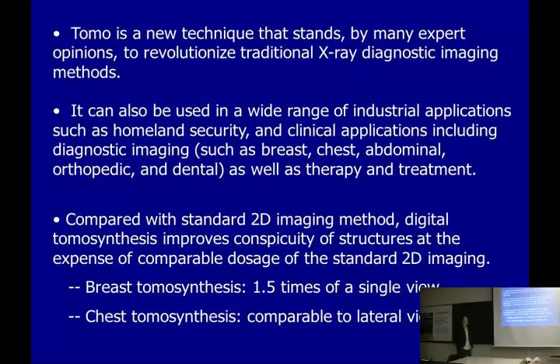Okay, so basically tomosynthesis is a new technology that many experts expect will revolutionize the traditional X-ray. The purpose of tomosynthesis is to try to replace traditional X-ray imaging, because by using a similar dosage and similar time, but with three-dimensional imaging, it gives you a much better view. And in other applications, when CT is not a good option, or when CT has a big concern of high dosage, tomosynthesis will also be a very good substitute.